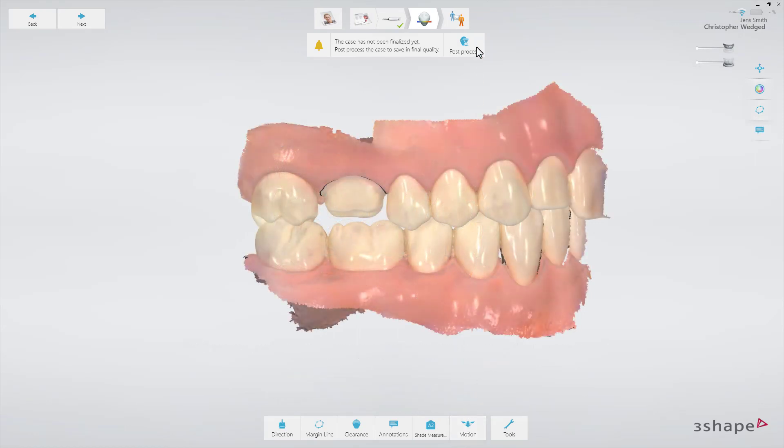Post-processing will be done automatically when you send an order. However, it is recommended to do post-processing at the analysis page if you wish to set the margin line before sending.